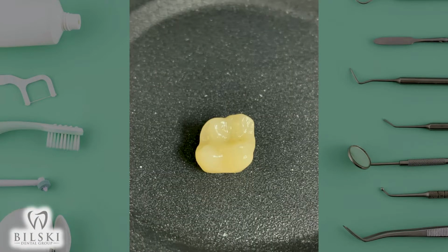Following that, this is what the tooth looks like. And I showed a yellow tooth because people think teeth are white, so they're not as white as that initial zirconia. But once it's fired properly, meaning vacuum fired in the kiln, the natural tooth color is representative of what the patient has. Right. There's 17 different colors that we can use. We can modify this tooth if we want to.